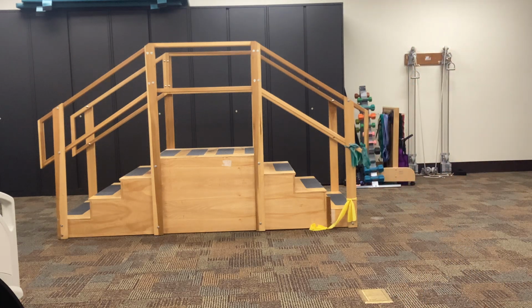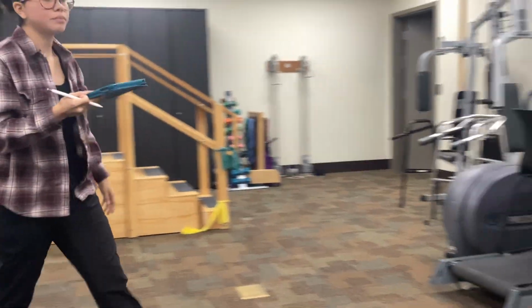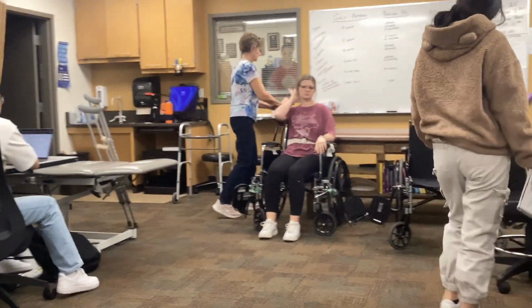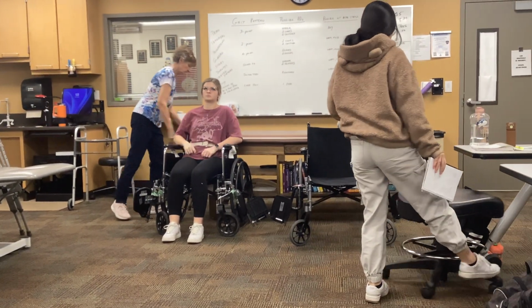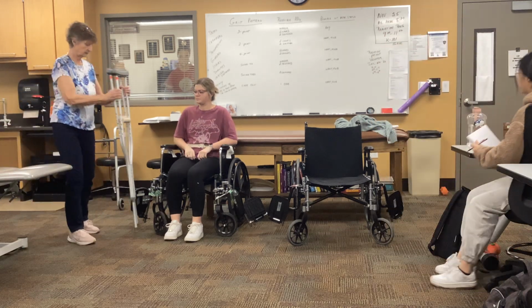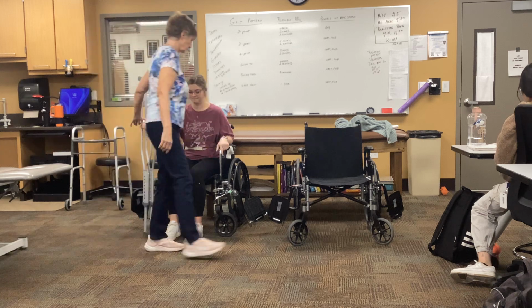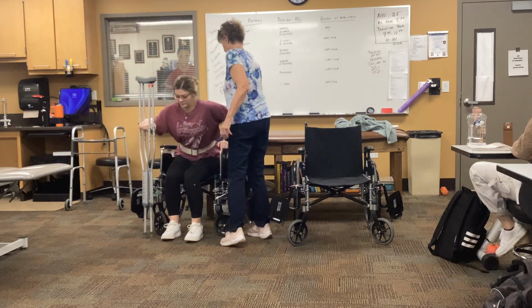So let's just take a look at crutches now with 2 points and 4 points. Alright, so we've got to go back to the way you stand up with crutches. Okay, go ahead, forward.